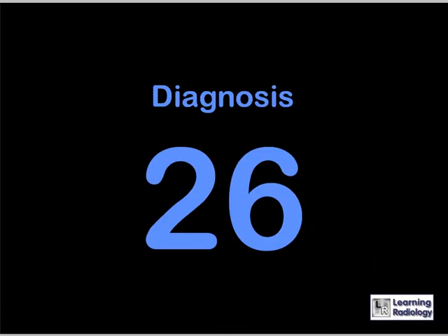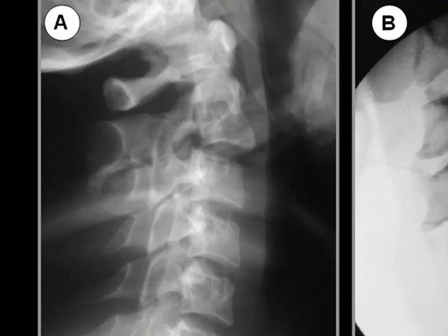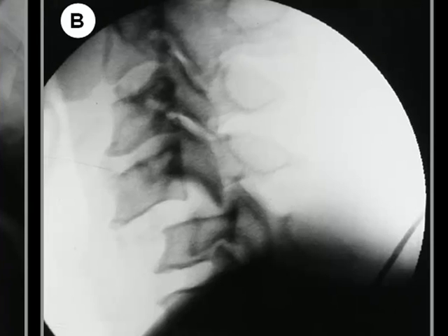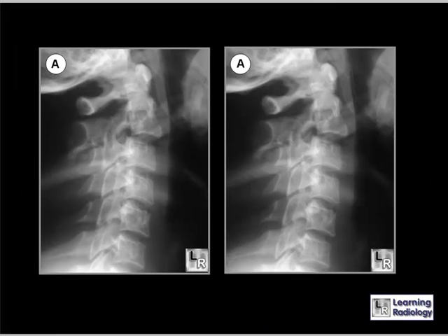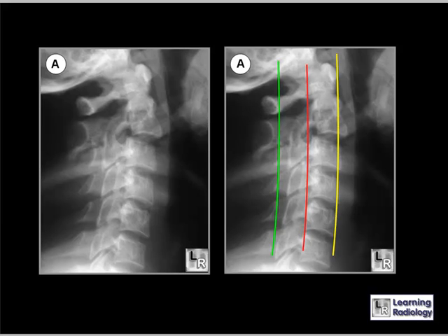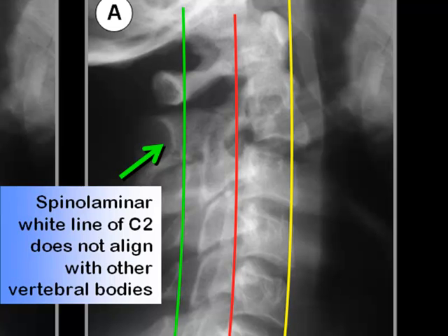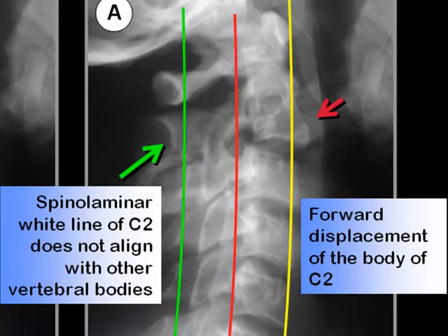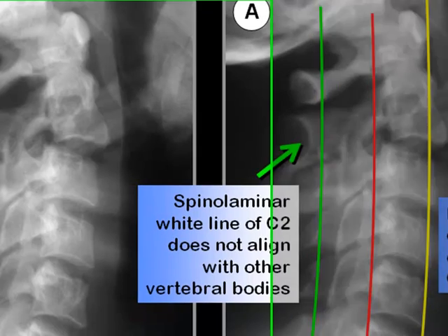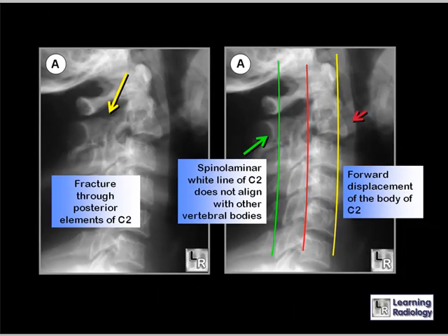Two different individuals fell, injuring their necks. In patient A, we observe the three lines connecting the anterior and posterior aspects of the vertebral bodies and the spinal laminar line — these three cervical lines should be parallel in a smooth curve. There is forward displacement of the body of C2 (red arrow), and the spinal laminar line of C2 does not align with the other vertebral bodies. This is a fracture through the posterior elements of C2, called a Hangman's fracture.